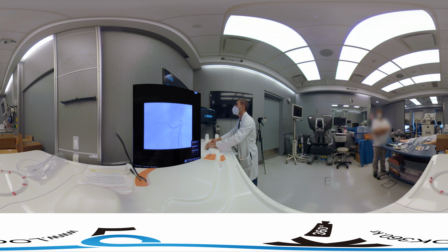So we'll come back just a little bit farther, and then just try to select that branch. There we go. And now we're in the branch that goes directly to the tumor. So what we're going to do is follow with our microcatheter. And our microcatheter is just right before that branch that goes right to the tumor.